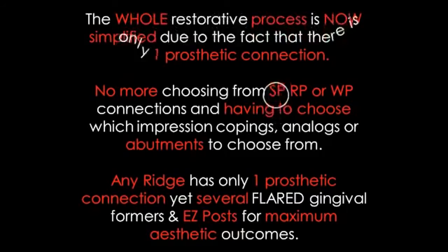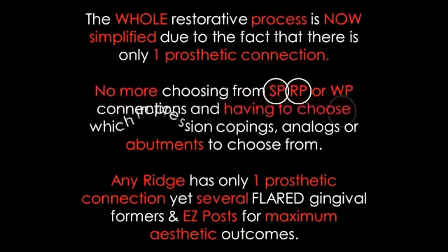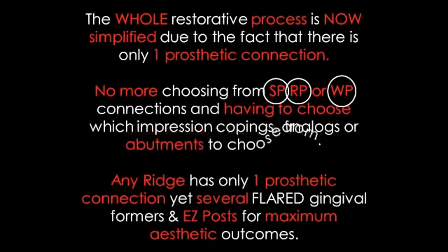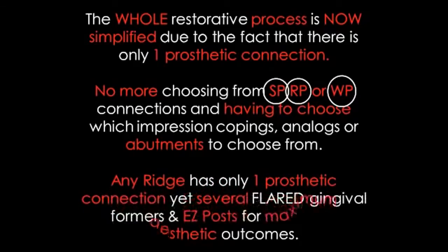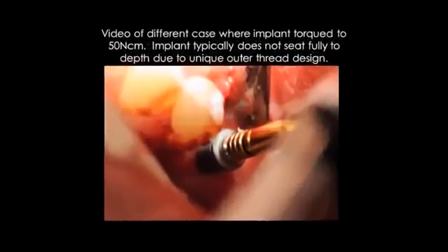One thing I cannot stress enough is I was a dental assistant for 13 years and had to keep stock of many different implant systems. Having one prosthetic table will definitely save you a lot of money and time, with no more small platform, regular platform, wide platform.